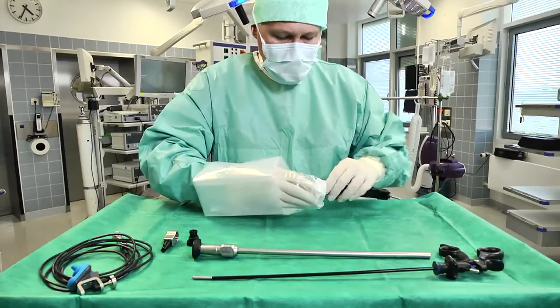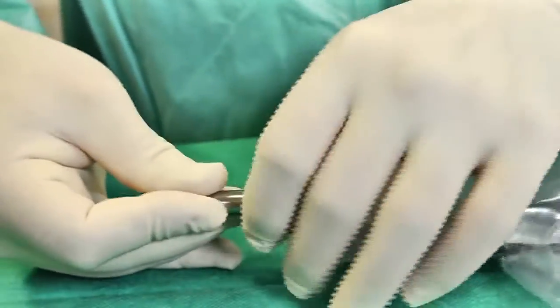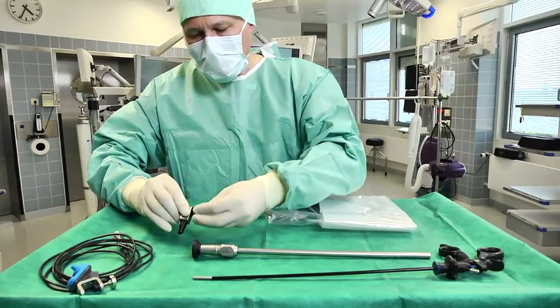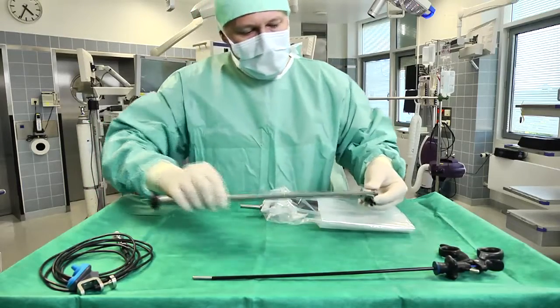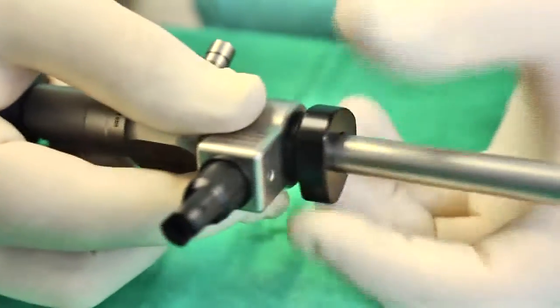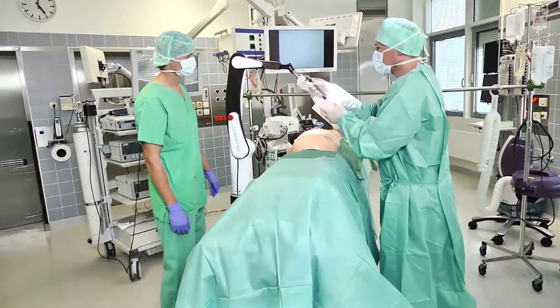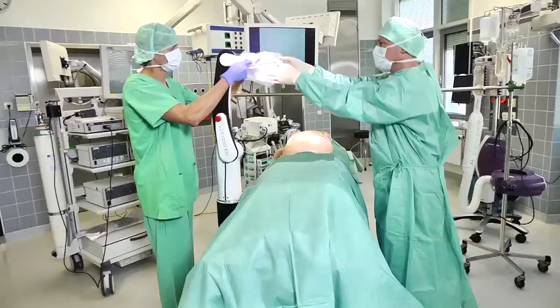The universal joint forms part of the sterilized components, and the surgical staff prepare the cover. Another part of the sterile set is the endoscope holder, which has been designed to accommodate all standard endoscopes. The universal joint is then fastened to the distal end of the Solo Assist, after which the Solo Assist is fitted with the sterile cover.